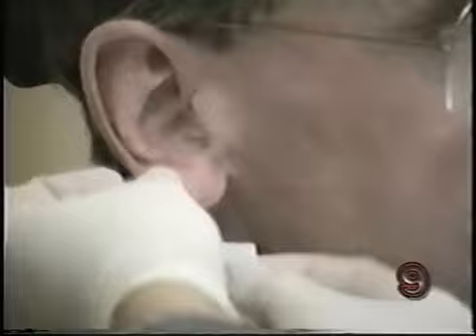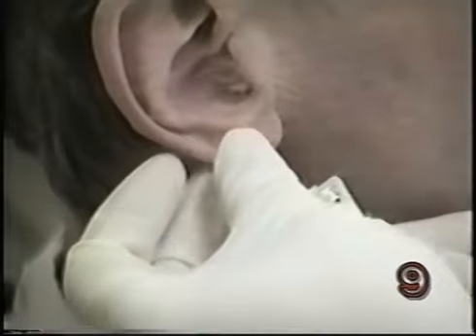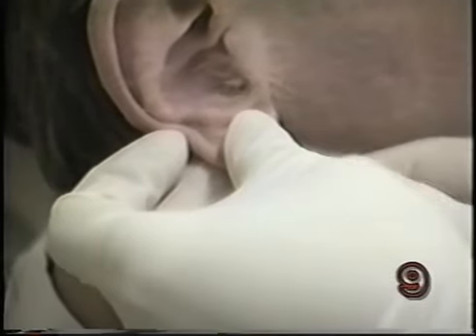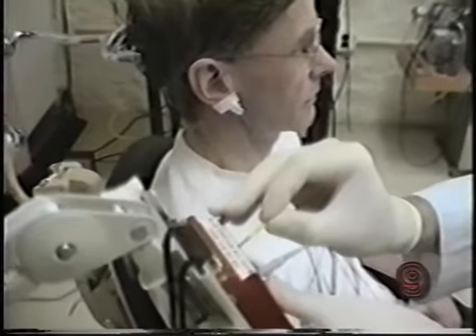Ground electrode is treated in the same way as surface electrodes. After the light abrasion, the ground is attached to the subject, and then to the recording system.